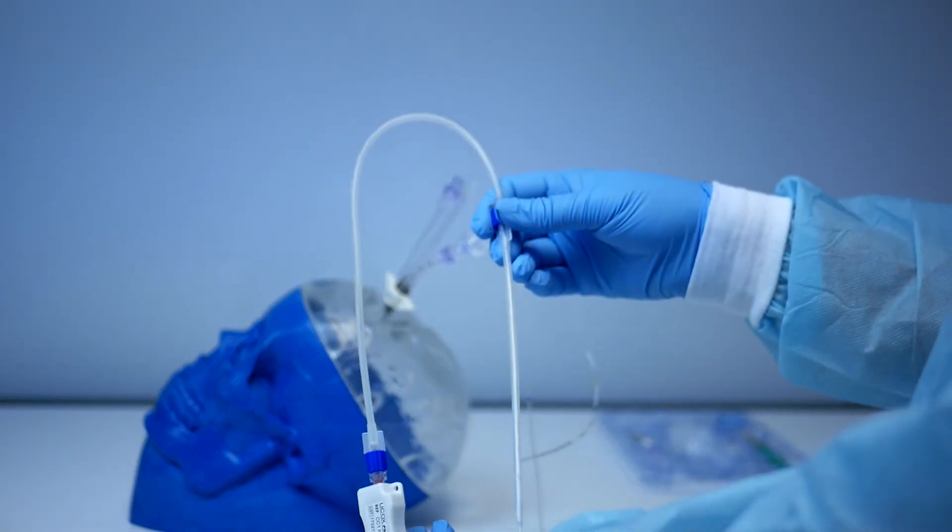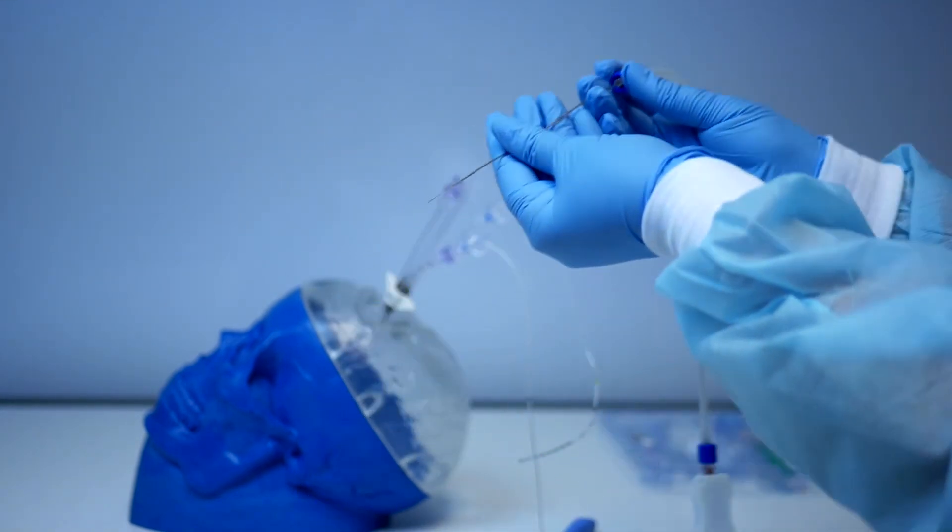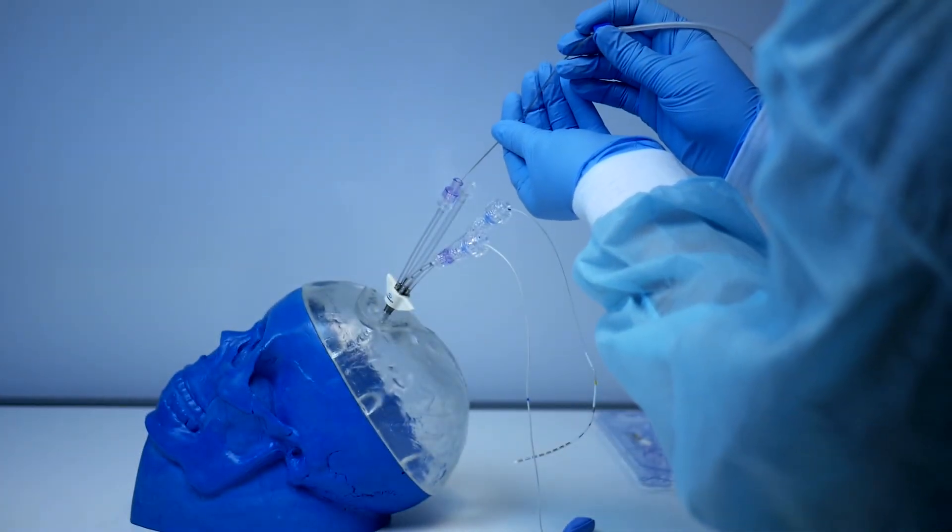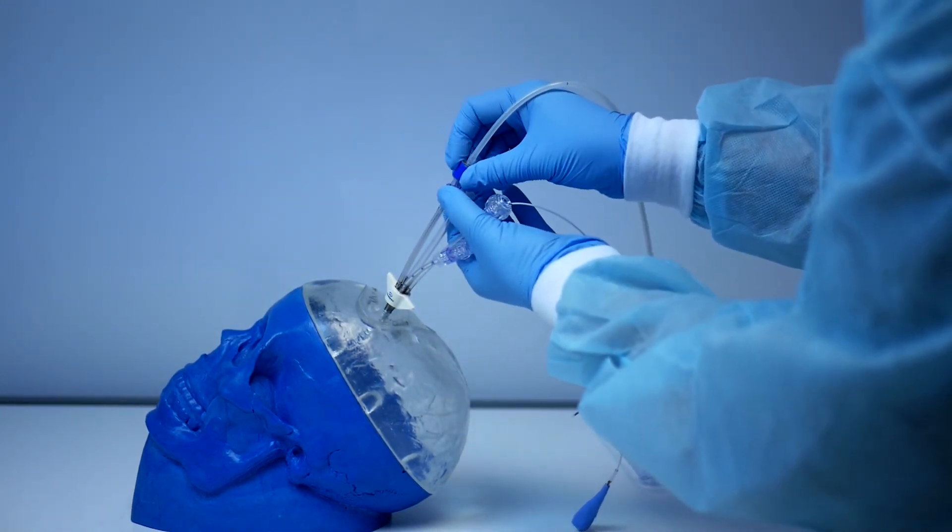Take the Lycox probe, remove the plastic sheath, insert probe through the introducer, and secure the lure lock connection by turning clockwise.